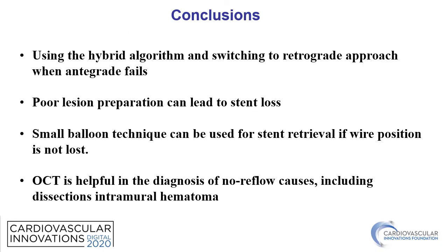So there are multiple lessons from this case. Number one is that using the hybrid algorithm can lead to a high success rate. In our case, although the CTO was very favorable for the antegrade approach, we tried, and when it failed, we switched to the retrograde approach in a timely fashion.